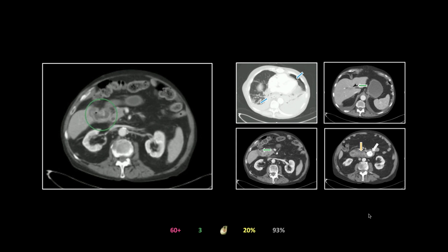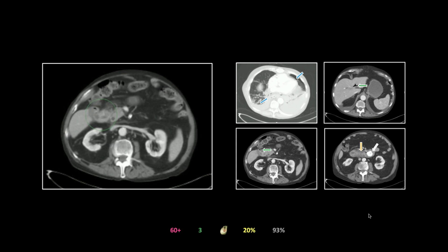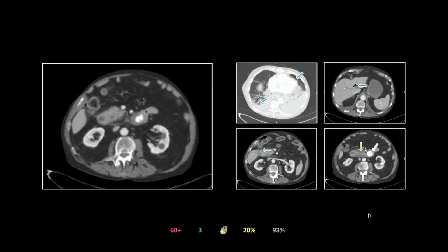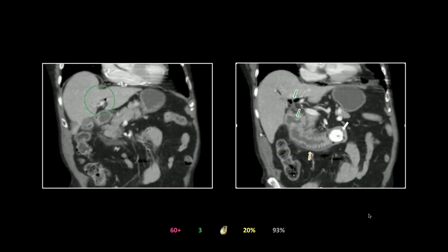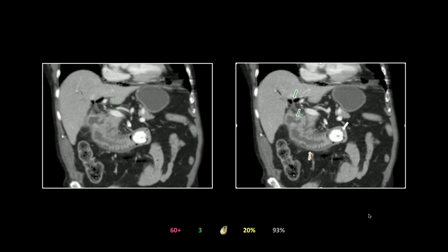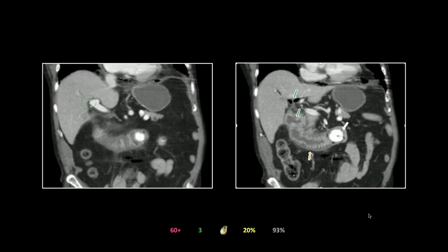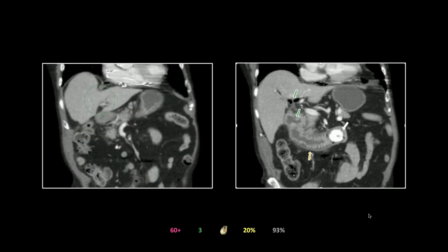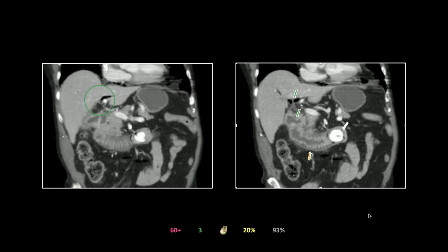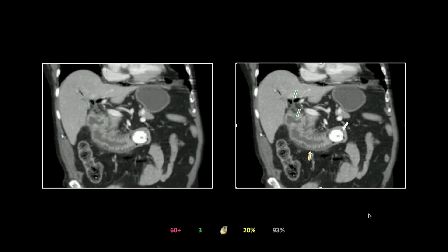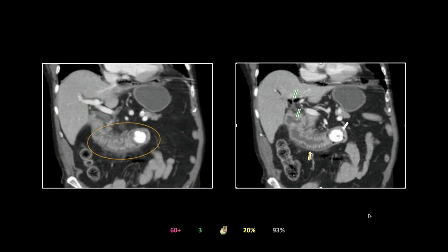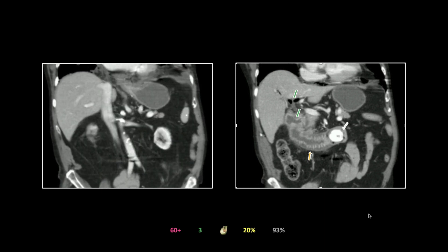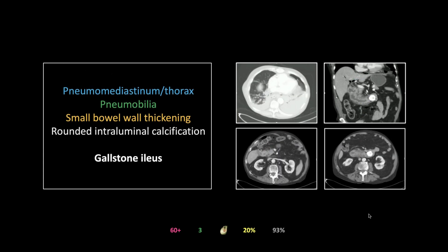This was actually a 90-year-old male and he did survive. On the coronals, there is a beautiful view of the fistula between the gallbladder and the duodenum, with more pneumobilia clearly visible — the communication from the gallbladder on the patient's right to the duodenal lumen on the left. That is a case of gallstone ileus.